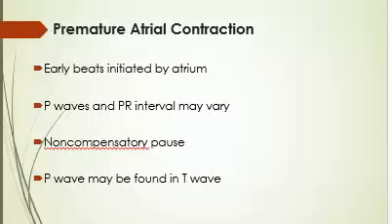So what ends up happening is your heart's beating, bump, bump, bump, bump, bump, bump. So it's just a little extra beat thrown in there. Whoop, slip one in. Gotcha. So if you don't pay attention, you can actually miss this. When it slips one in on you, it kind of has to pause a little bit just so it can get itself back together. Because, oops, one slid in, now let's get back on track. So that's what I mean when I say a non-compensatory pause that comes afterward, okay?